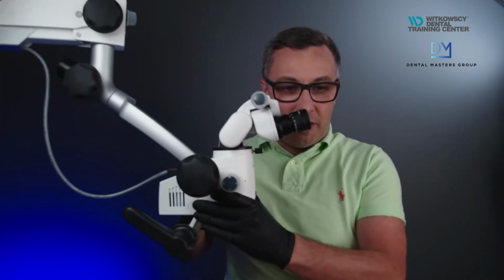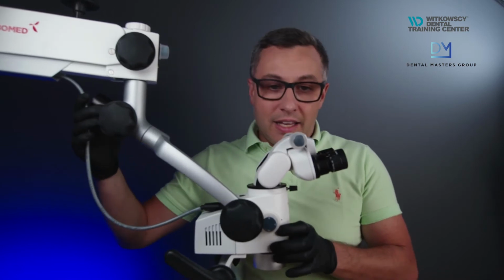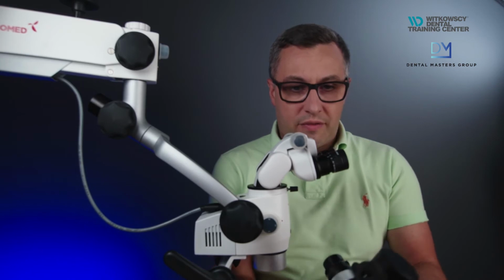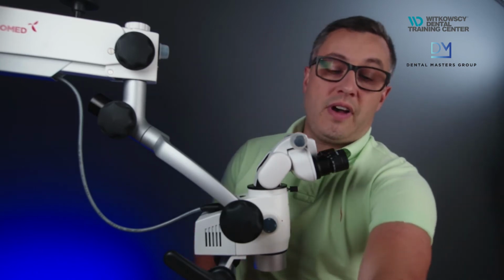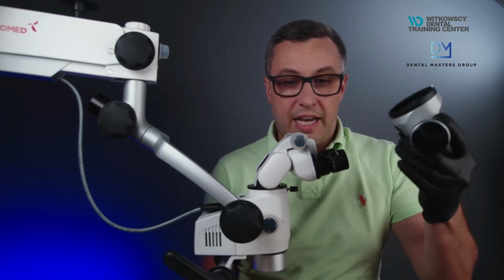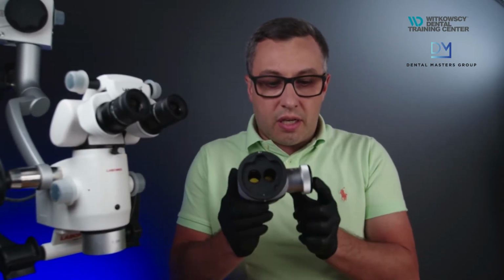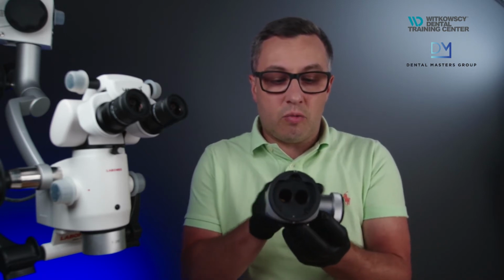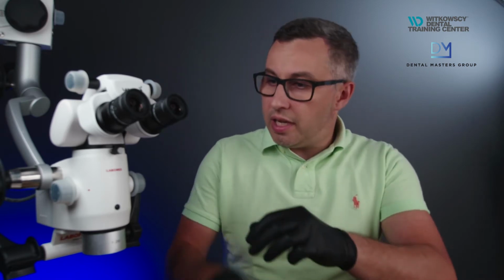So, look here. This is the microscope that we will be installing this device on. But, of course, when you have this part, it's impossible to connect this without something like this. Sorry. With something like this, you can put your adapter on one side, and you can have a one-sided or two-sided adapter. So how are we mounting this?